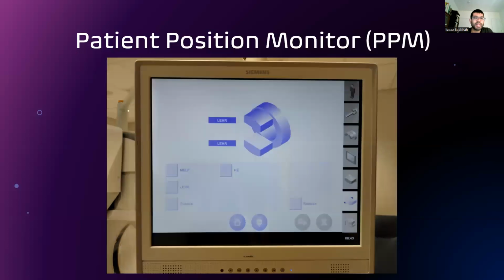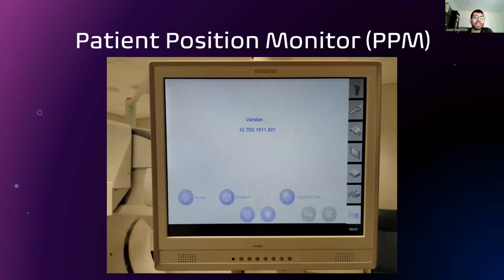This is the collimator change screen. This is what initiates the change of collimator on the detectors, like we saw earlier to change to a pinhole. First press the desired collimator you wish to switch to, then press the Proceed button when it turns green. The final screen allows us to perform the touchpad test, or to shut down the camera, such as at the end of the day.